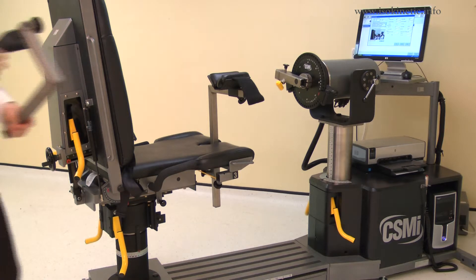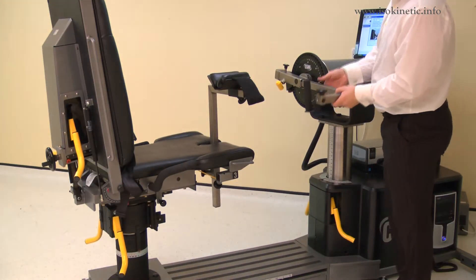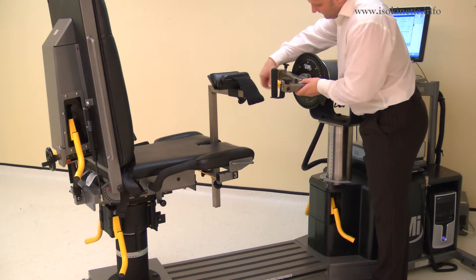Install the wrist shoulder adapter into the short end of the input arm. Ensure the handle face is away from the dynamometer face. Pull the locking pin to allow full installation. Secure with the locking screw.